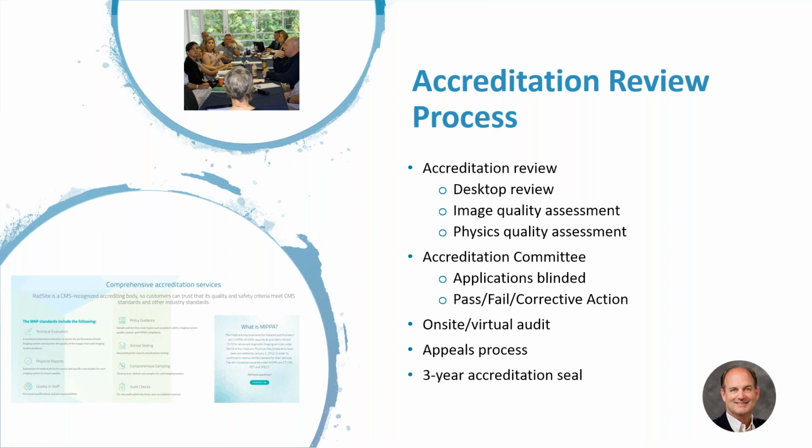And there are 3 reviewers, one for each section. One will do the desktop reviews. She will review all of the answers to your questions. She'll review all of the documents you've uploaded and get back to you if there are any issues. Then a radiologist will review your images. And again, if there are any issues, we do an RFI and get back to you. The same with the physics. We have our physicist reviewer who does the physics review.